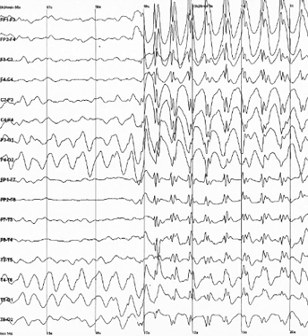The EEG in childhood generally has slower frequency oscillations than the adult EEG. The normal EEG also varies depending on state. The EEG is used along with other measurements, EOG and EMG, to define sleep stages in polysomnography.